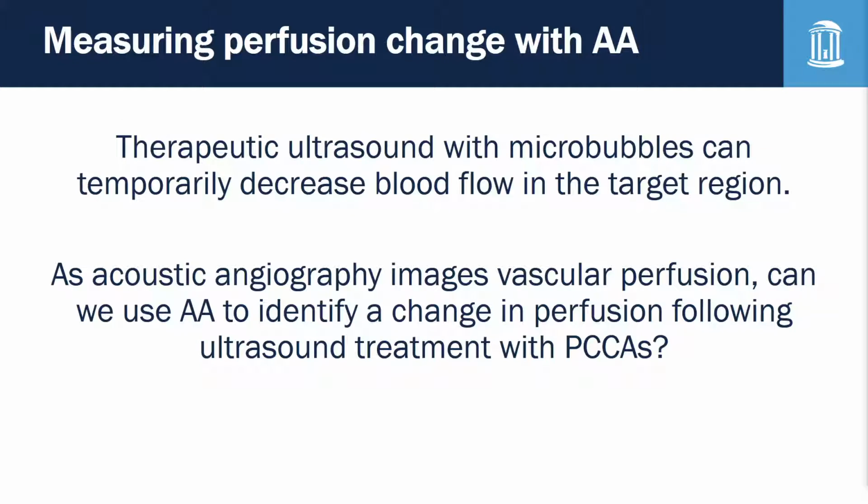It's been observed that therapeutic ultrasound combined with microbubbles to target an area for drug delivery can sometimes result in a decreased blood flow to the target region immediately following treatment. As acoustic angiography is a visualization of vascular perfusion, are we able to use acoustic angiography to determine a change from before treatment to after treatment?